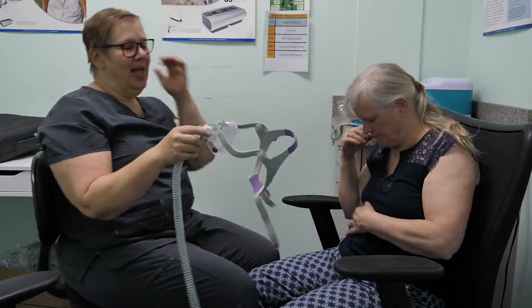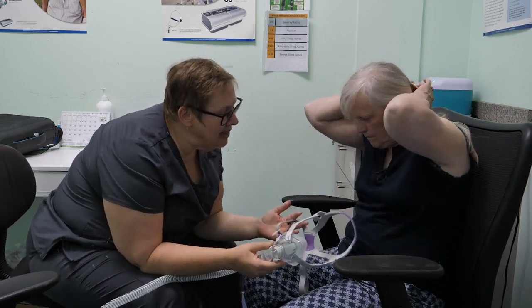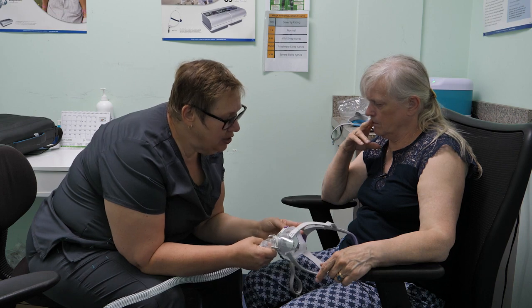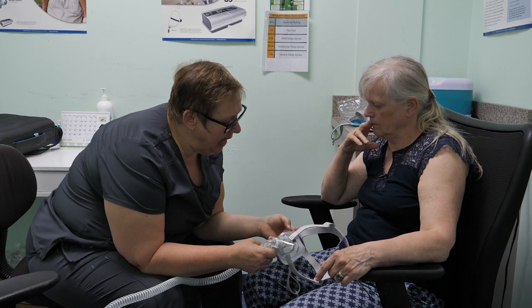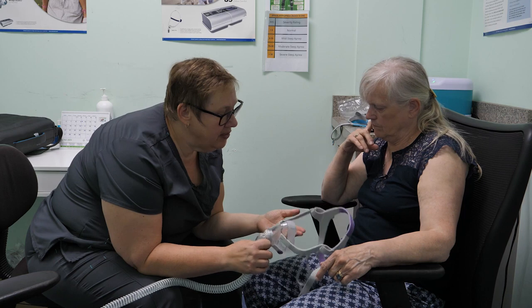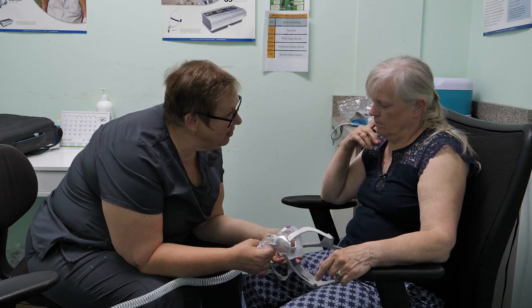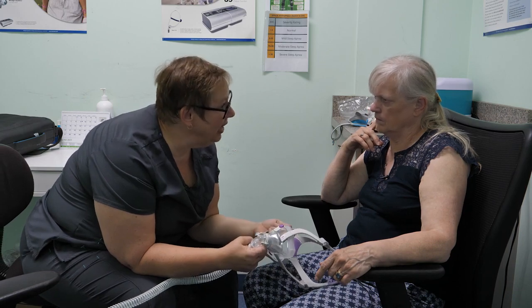Yeah. There we go. So one of the things I tell all my clients is, when you have found a mask that works for you, you take it home at night, not with the demo, but when you purchase one, and you wear it the first night to make sure that you have a good fit. And then I want you to take a black permanent marker and mark where your straps are. That way, after you wash it, you know exactly where to put your straps. Or if you're finding that you're having to move your straps back farther and farther, that means the headgear is stretched and it might be time to look at buying a new one.